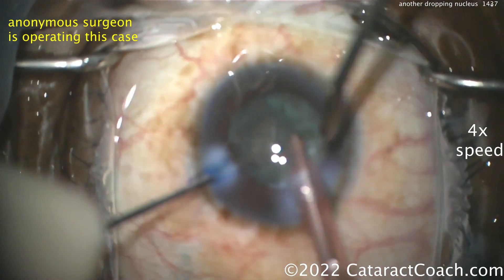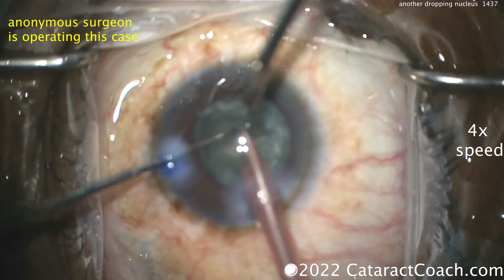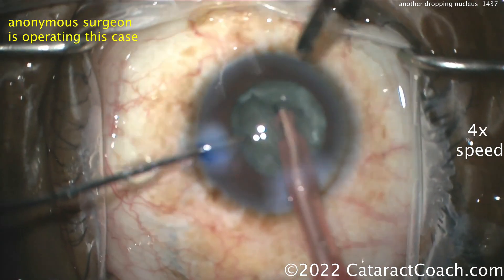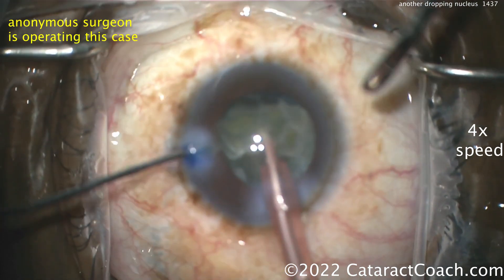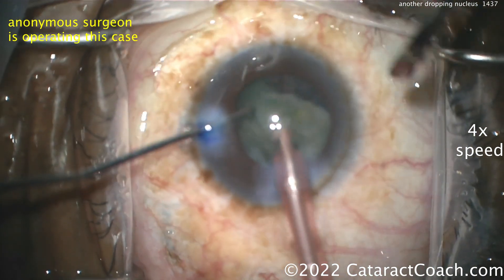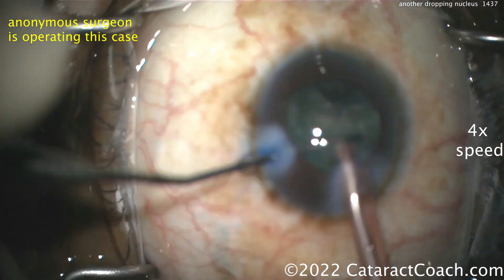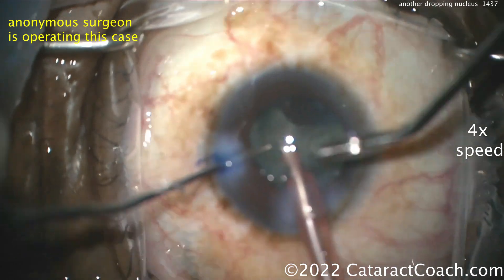We're watching this video at four times normal speed. The surgeon is obviously stressed — look at the amount of accommodation happening. The surgeon has a clearer view through the oculars because they're accommodating, but look at the microscope view — it's a little bit blurry. Getting the pieces out of the capsular bag is really hard to make out.